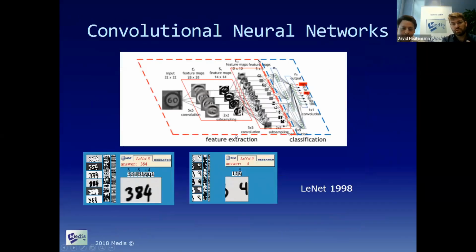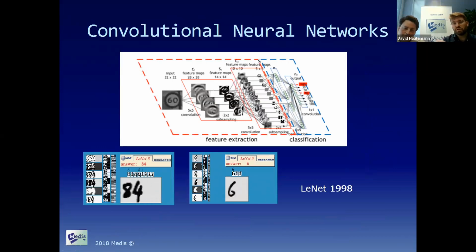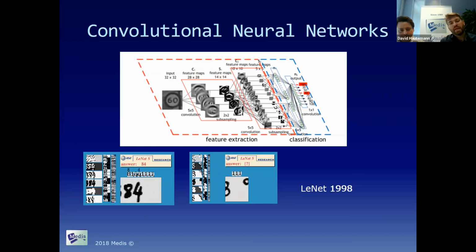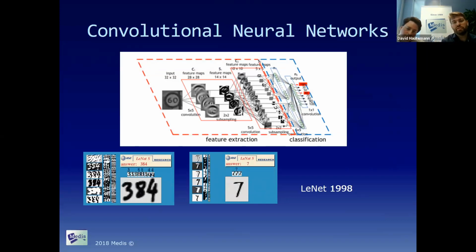Also, this idea of looking at images and predicting something, specifically the convolutional neural networks, which is again a mathematical way where you actually slide over an image in sort of a window, looking at a patch of the image, and multiple patches can interact with each other, and things get extracted at different levels.